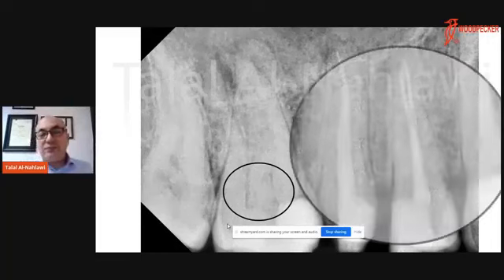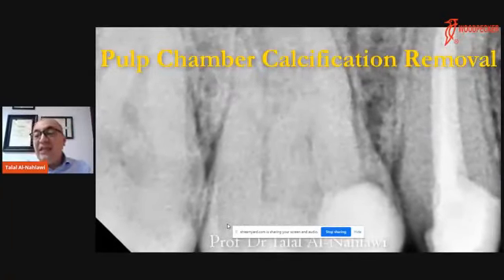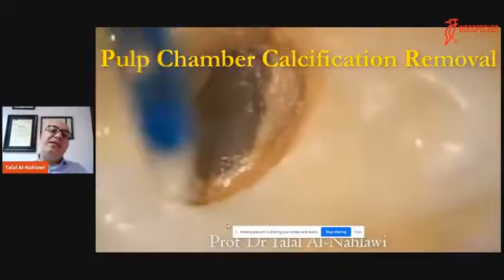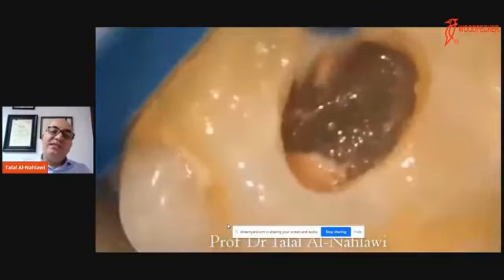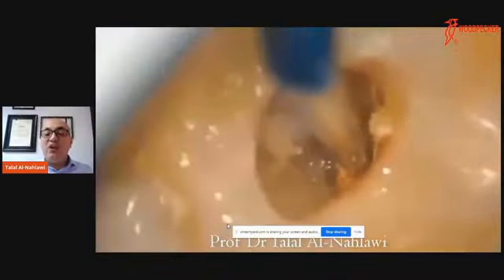As you can see, by magnification of the X-ray, you can see that the pulp chamber was totally filled with a huge pulp stone. If I don't realize this, I will keep using the high speed till I reach the furcation area, and maybe I will end up with a perforation. So it's very important to understand this from the very beginning. Here, once I can see that there's a penetration in the pulp chamber, I will start using the T3 because it is, as I told you, strong, and it can withstand high power settings, as you can see on the other hand. So it will be powerful in order to remove the huge calcification.